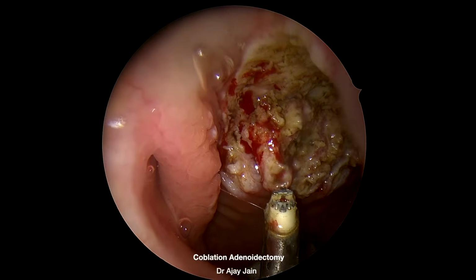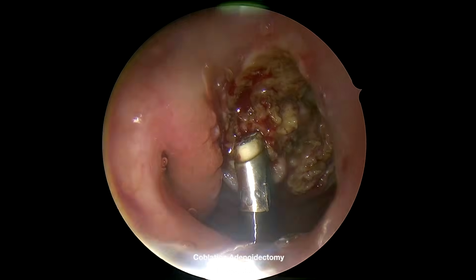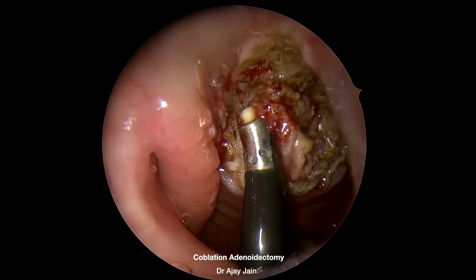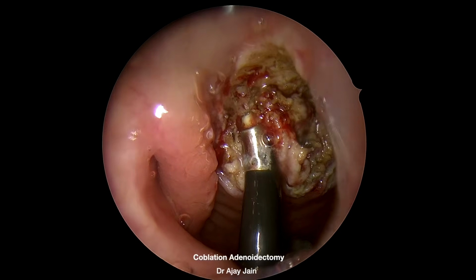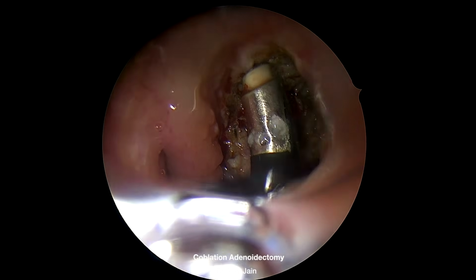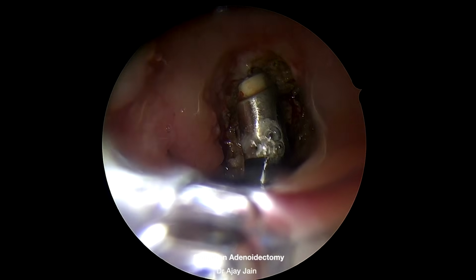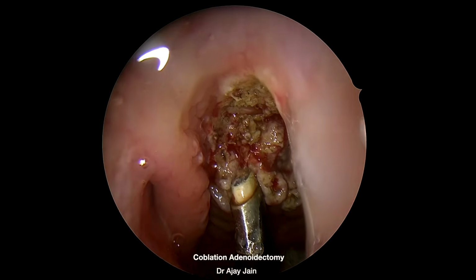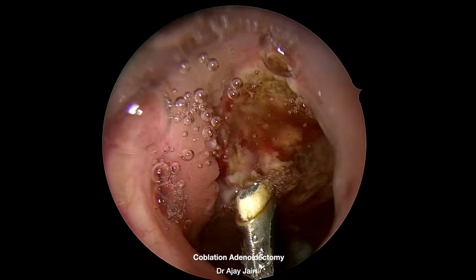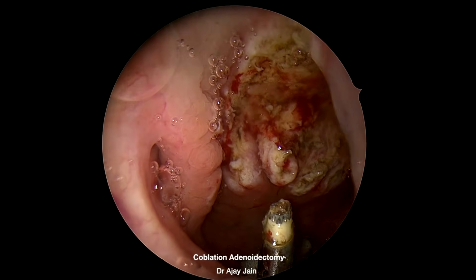Now I have come to the right hand side. I know this side some adenoid tissue is there, which I can compare from the left side experience. Always I try to remove or debulk as much adenoid tissue as possible because I am afraid that the wand may deceive anytime.